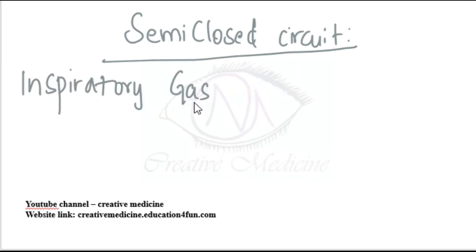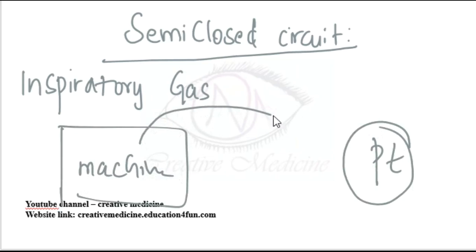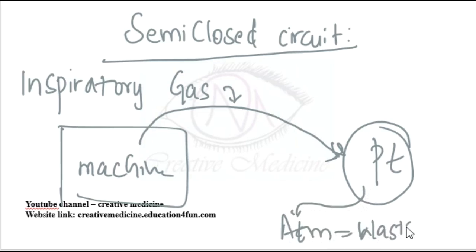Did I draw a diagram? No. Okay, I'll draw a diagram here. Think that this is the anesthesia machine, and this is the patient. From the machine, it pumps inspiratory gases to the patient. After the patient takes the inspiratory gases, metabolism occurs and expiratory gases are generated. These expiratory gases are released into the atmosphere. So this is the semi-closed circuit, where all the expiratory gases are released into the atmosphere.